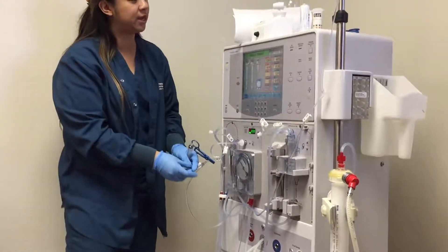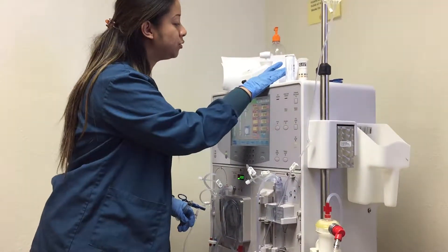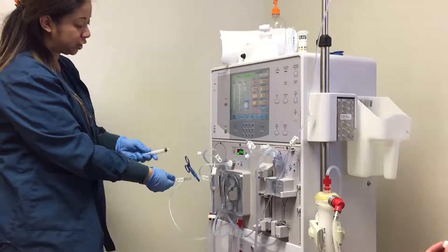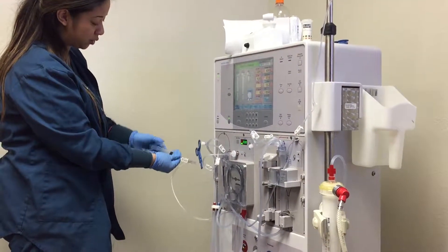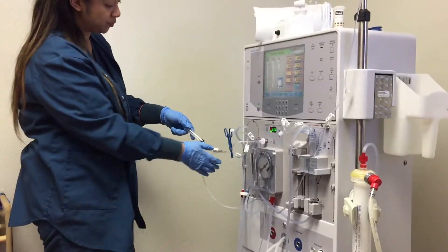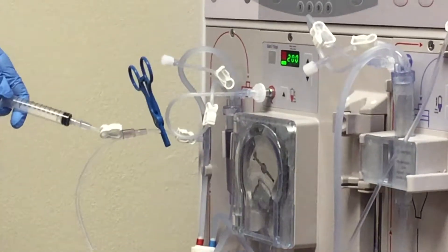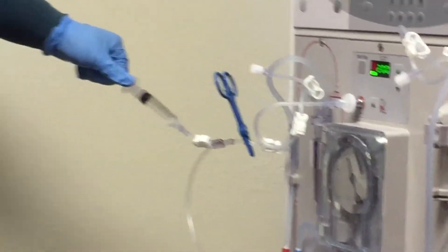Line right here. Normally it has a cover, but it's okay. So you're going to draw your 10 cc's. Go ahead and put your 10 cc syringe. Unclamp both of your saline lines and you're going to draw 10 cc's from the syringe.